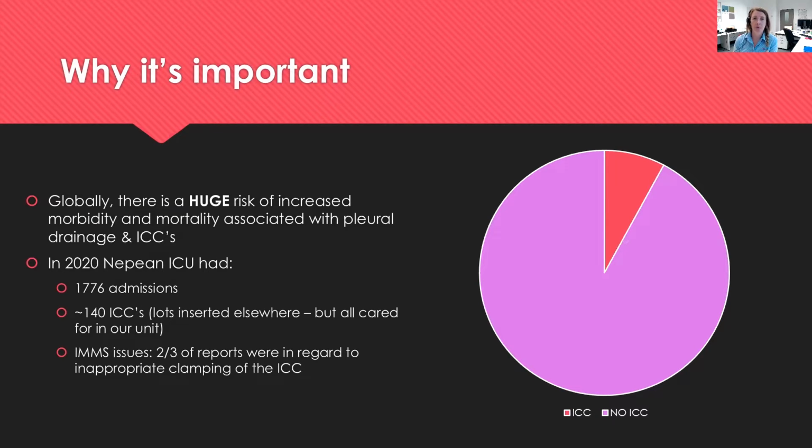Why are ICCs so important? Why is it important that we raise awareness about these devices and we talk about it? Well, when we think about medical devices, and particularly lines, tubes, cannulas, and things that we insert in patients in a clinical environment, in a hospital environment, they all come with various degrees of risk. An ICC is a device that carries quite a significant amount of risk, because in the event that it is kinked, clamped, disconnected, elevated, things like that, things that seem quite easy and simple complications, like things that can easily happen, there's potential for very serious outcomes, including death for the patient.